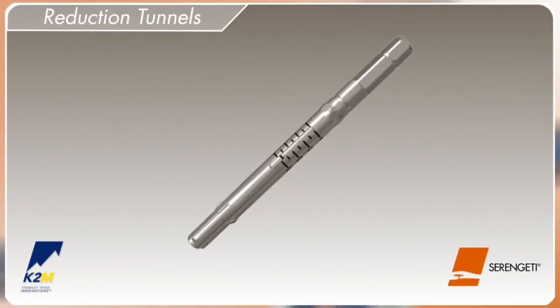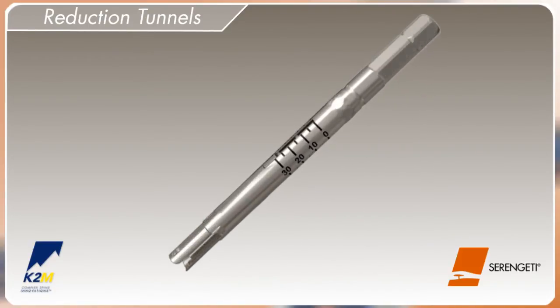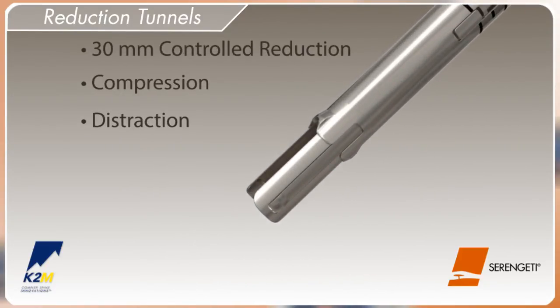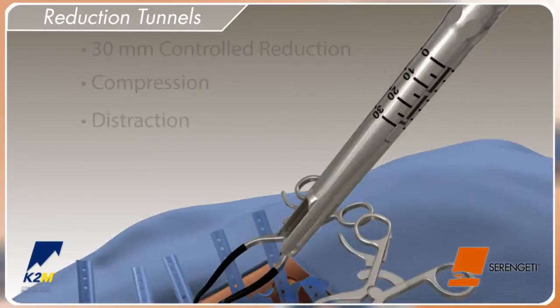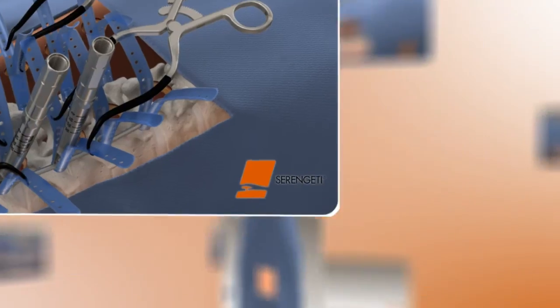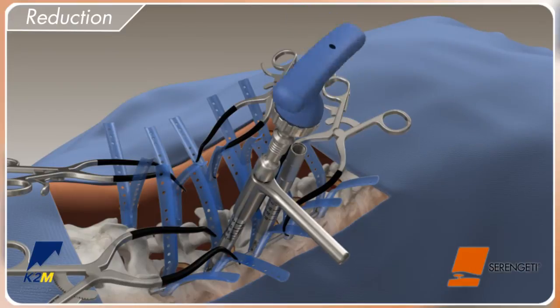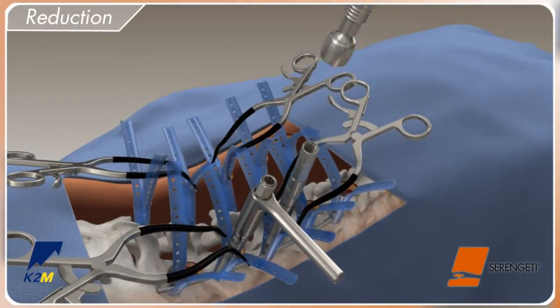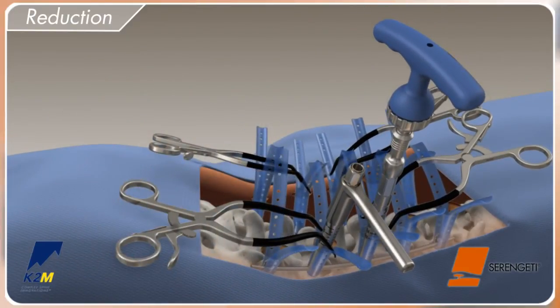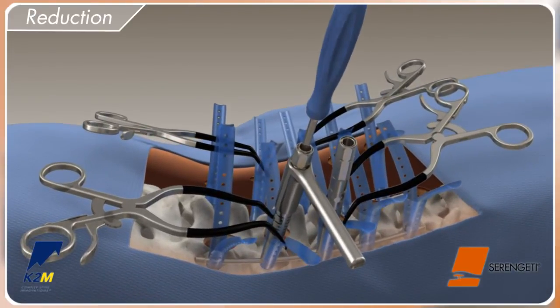For reduction, compression, distraction, and other manipulation, the minimally invasive reduction tunnels can be used. These reduction tunnels provide 30 mm of controlled reduction, compression, and distraction. Determine the orientation of the screw head and apply downward pressure directly over the screw to attach the reduction tunnel. Slide the anti-torque handle over the MI reduction tunnel and, with a quick connect handle attached to the adapter chuck, reduce the rod. The line on the measurement window will line up with zero to confirm the rod is fully reduced. Set screws may be placed using the short driver and provisionally tightened through the cannulated MI reduction tunnels.